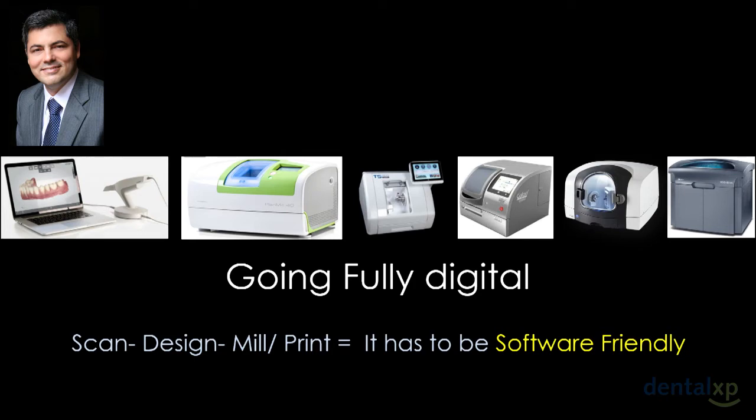We can scan the patient, we can make the design, we can mill, we can print, but it has to be software friendly. Back in 2007, 2008, we were going crazy, Dr. Picos and I, trying to figure out all this technology and how to put it to work together, because the software was the big problem. Communicating the device meant sometimes doing reverse engineering on the available softwares, and it was hell.